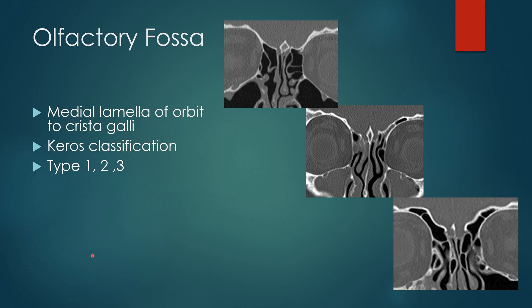The olfactory fossa is measured from the medial lamella of the orbit — where the roof meets the medial wall — to the crista galli, measuring the depth of that olfactory fossa. There is the Keros classification: Keros type 1 is less than 4 millimeters deep, Keros type 2 is between 4 and 7 millimeters deep, and Keros type 3 is greater than 7 millimeters deep. You measure both sides of the olfactory fossa.